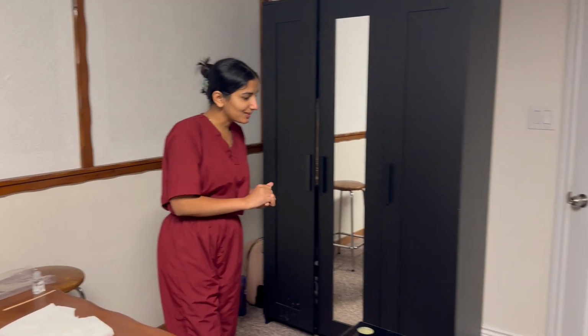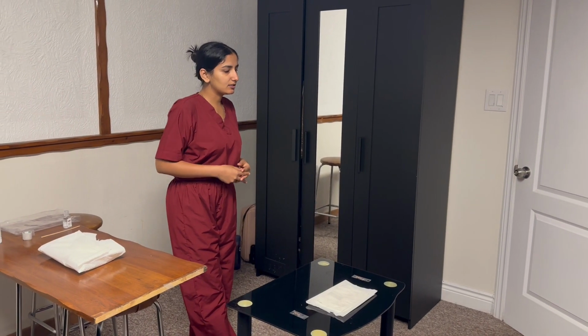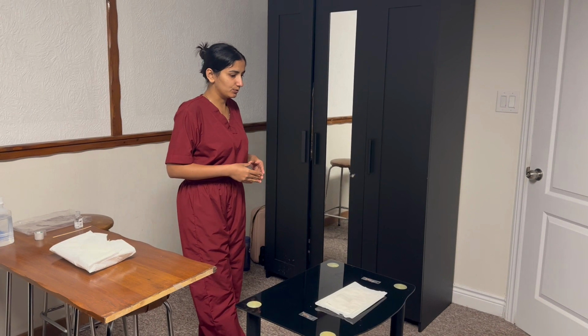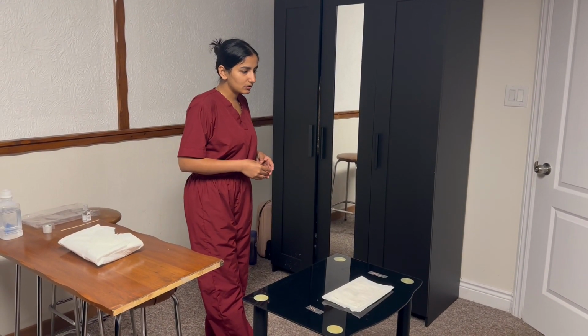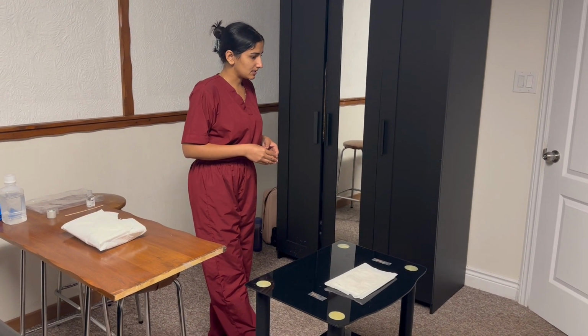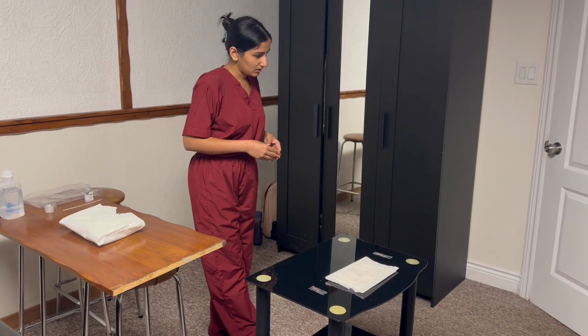Hi, how are you feeling today? Good. I am Sukhman Kaur and I am your nurse today. I have checked the doctor's orders and I have the orders for ambulation and to change the dressing of your wound. It will take around 10 minutes because in this procedure I will remove the old dressing, I will assess the wound, and after cleaning it I will put the new dressing. If that's okay for you, I will now proceed with my procedure. Yes? Thank you for your consent.